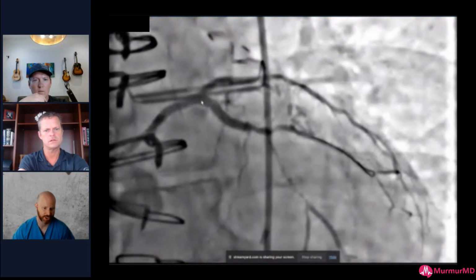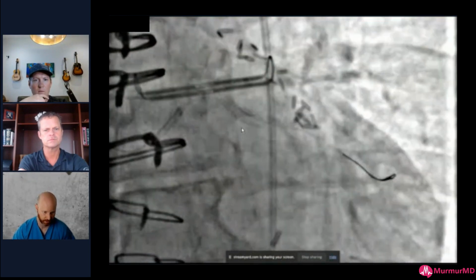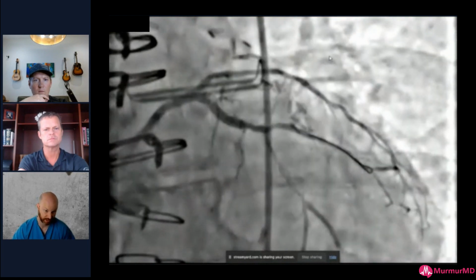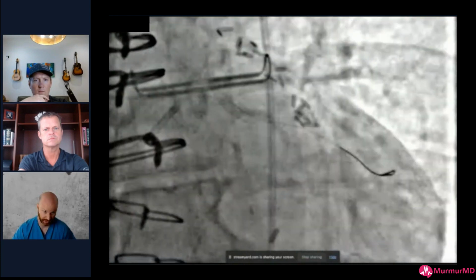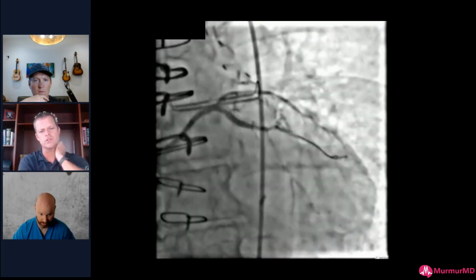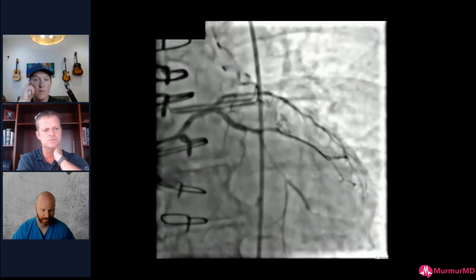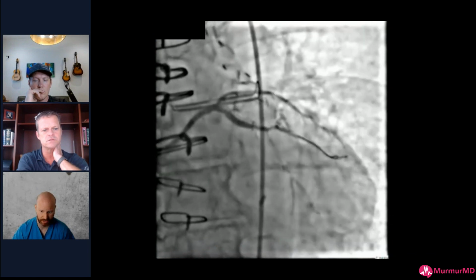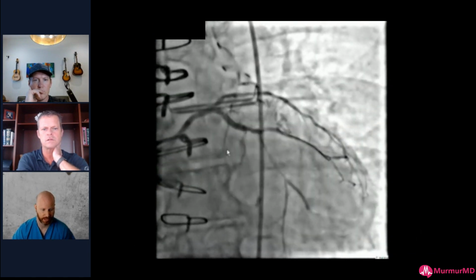But you can appreciate how underexpanded this previous stent was and how much bigger you can really make this vessel. I'll show you the IVUS now, but it's a lot bigger than I think was appreciated without imaging. And I'll show you the nodule here. So you stented, most of that was through a prior stent. Yeah, and we expanded that prior stent before we did the... It's trying to load my IVUS here.